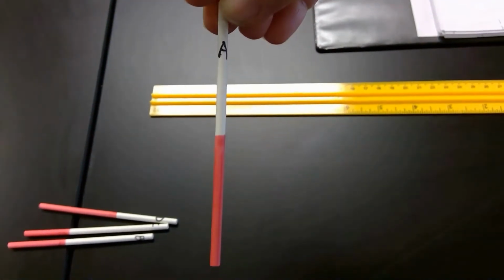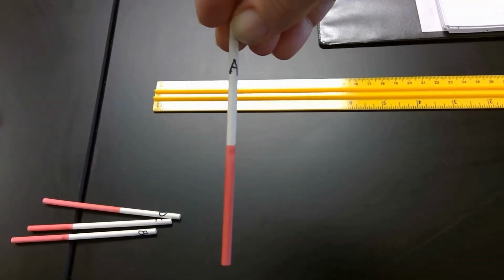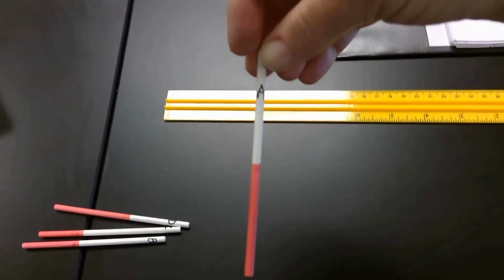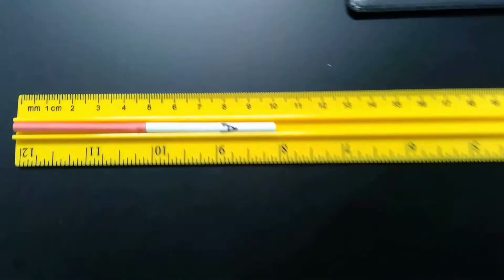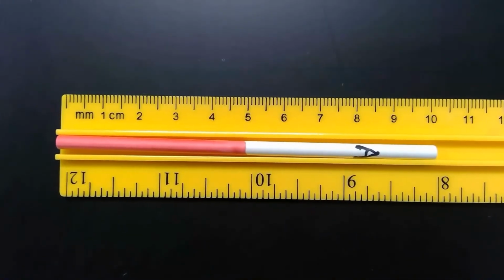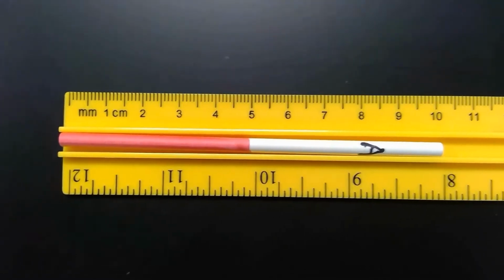Then all you do is see how much total blood there is, the plasma and the red blood cells together, how much of it is red blood cells, and you divide to get the percentage. So the math is really easy. If you put this here, you can see that the tube is 10 centimeters altogether. So the total blood in this tube is 10 centimeters.